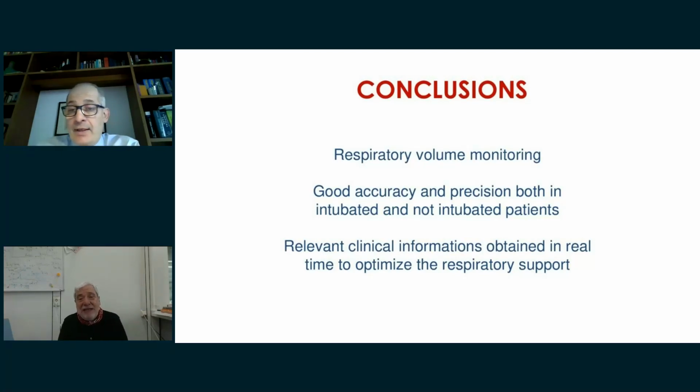Okay, but once again, I think we may speak realistically about this kind of thing only if we measure it. We must measure inspiratory effort with an esophageal balloon, rather than only knowing how much the tidal volume is. Tidal volume is the outcome. For the inspiratory effort, you have to look at the motor.